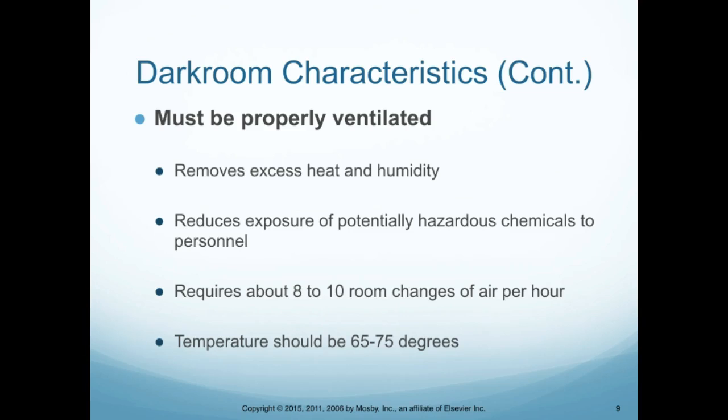So it must be ventilated well. It removes the excess heat in there, and like I said, being a darkroom tech myself, it does get very, very warm in there, especially when we started having angio cases and had 30 films to run at each time. So it removes the excess heat and humidity. It reduces exposure of potentially hazardous chemicals to personnel. I'm here to prove that it didn't affect me at all.